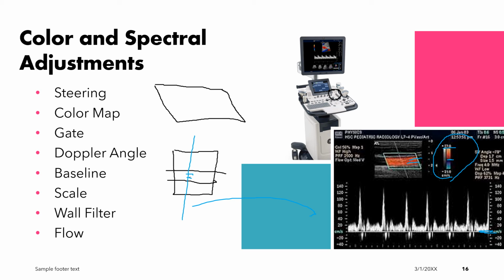Now, one thing I didn't talk a lot about, but Doppler, it detects all motion. We really use it for vascular assessment, but it can also be used to look for urinary jets coming into the bladder or any other kind of motion in the body. The system is not that brilliant that it can differentiate tissue or urine motion from blood flow. So we have to be aware that we're always going to detect motion besides vascularity.